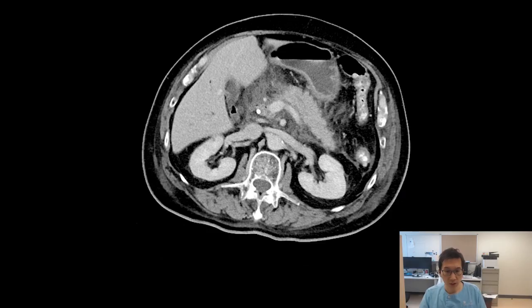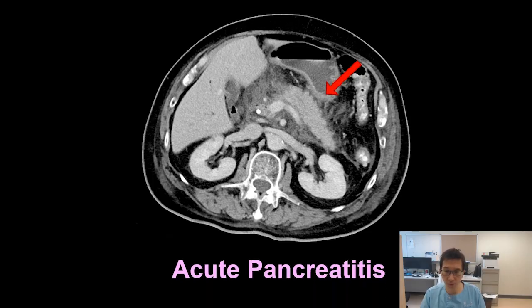As mentioned earlier, CT or radiology is also extremely helpful in establishing alternative diagnoses. And here we have an image of acute pancreatitis, which can present with similar symptoms to a liver abscess, with abdominal pain, rigors, chills, hypotension, multi-organ failure, AKI. And so CT here can be extremely helpful in looking at a non-infectious, or at least initially non-infectious, surgical abdomen.